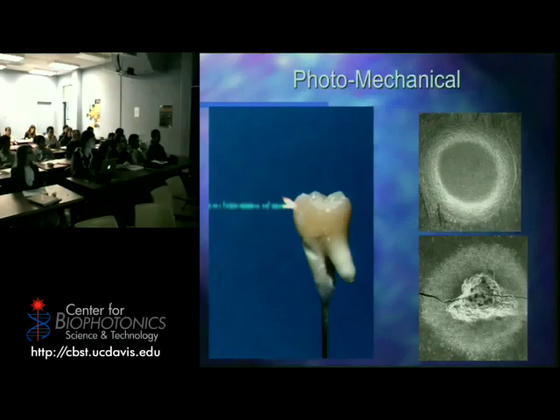Basically, the idea is that I can use a laser and deposit enough energy. As you can see here, a laser is hitting the enamel of a tooth, and it's causing a little plasma to be ejected. So basically, it's blasting that tooth. It's depositing a whole bunch of heat that's causing that enamel to break down and basically vaporize. Depending on the amount of power deposited, I can get this kind of effect on the surface of the tooth, where I remove a nice little circular layer. So if I was trying to fill your cavity, I wanted to remove the bad part, I could go in and shoot pulses of this, removing layers of your enamel.